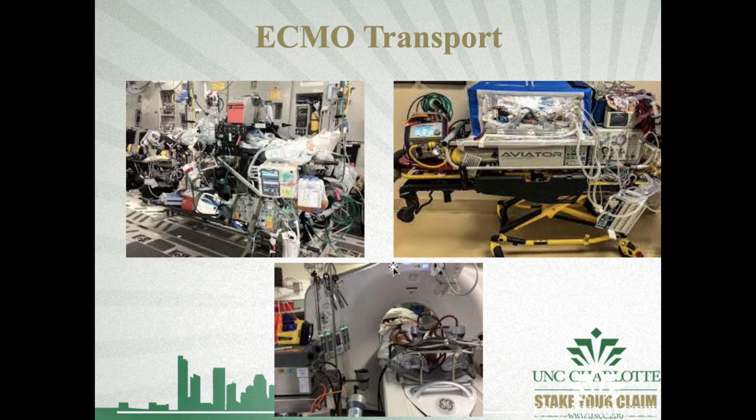Here's an example of some ECMO transport. Here's some intra-hospital transport right here and here. And here would be some life flight activities, and you can see how intense it is. Taking an ECMO patient to CT, honestly, it terrifies me, it drives me insane. And they're always going to have pump issues when they go in there. It's actually a very scary process, but it's doable. These machines are very portable, as you can see here. Here's a CardioHelp right here. And here's a baby in a box. But ECMO transport is a skill. If you're an ECMO specialist, you have to be relatively comfortable with it and very proficient, because anything can go wrong, and you're not losing an airway, you're losing a cannula in a major vessel, and that's not a really good look to have.